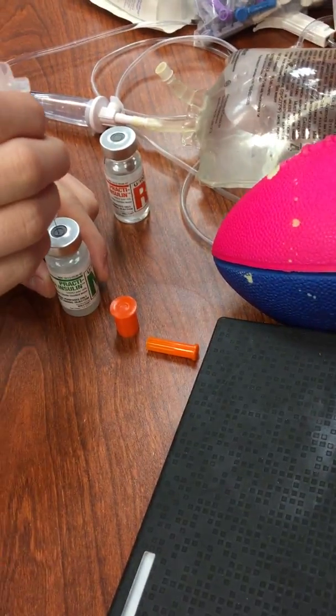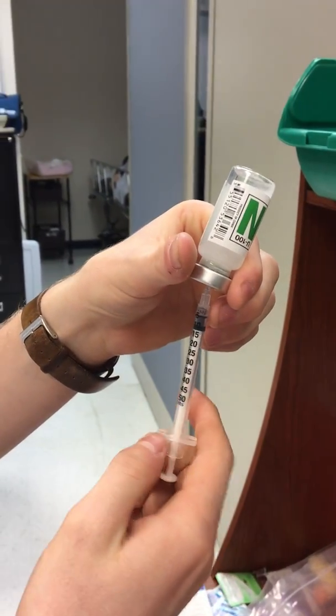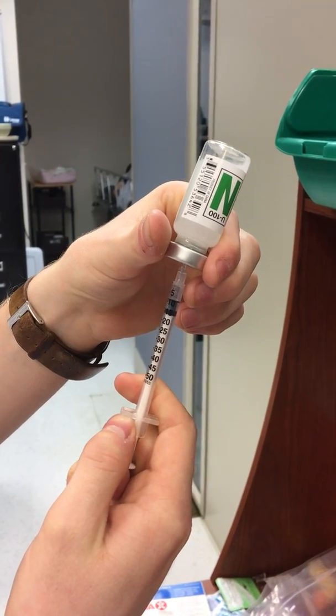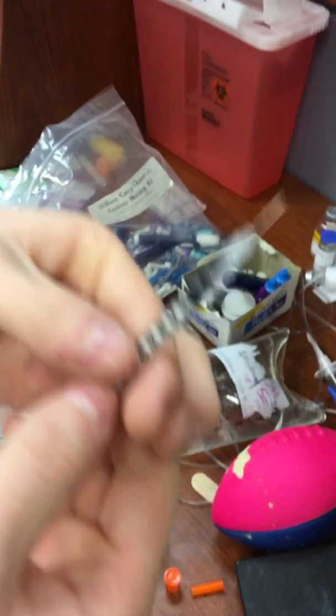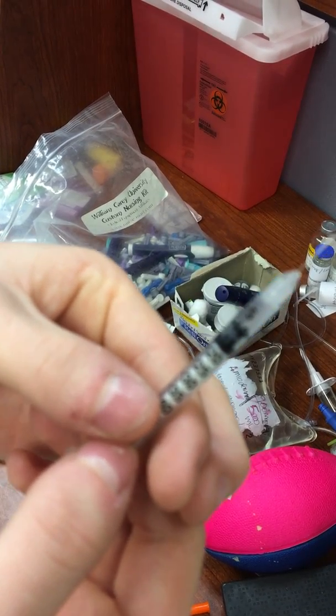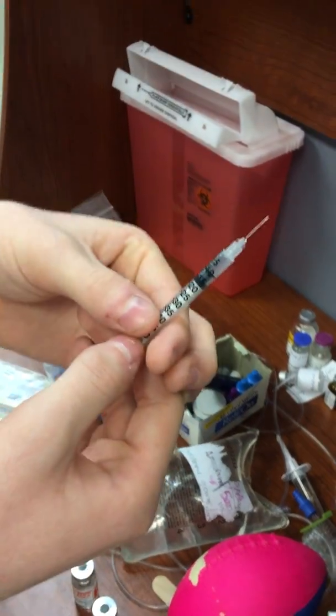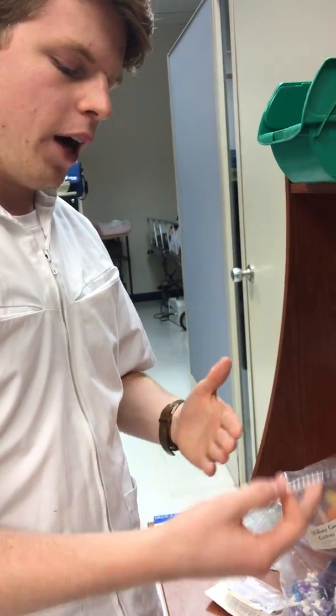Okay, got 5 units. And now, being careful not to inject any of the insulin into the NPH, I'm going to draw back 5 units of the NPH insulin, which should give me 10 units. And it's important to make sure to verify with another nurse. I would give them the insulin syringe and have them tell me how many units they see. If we have the same number, then I know I've done it correctly. If not, then I need to discard the syringe and redo it. So I've got the right amount of insulin.